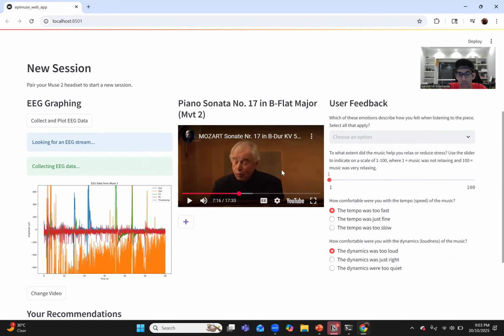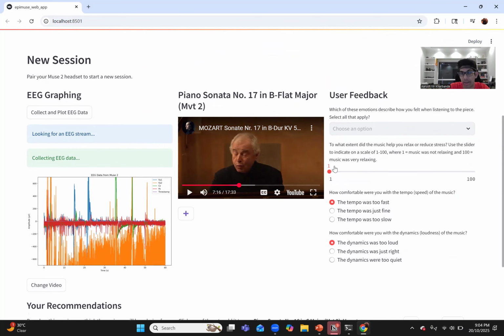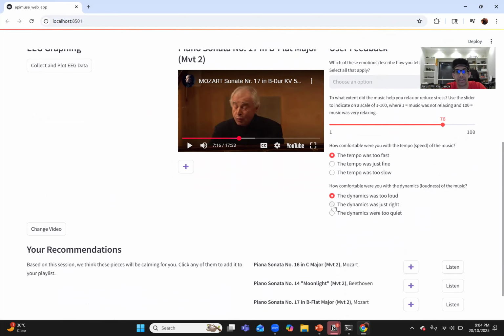Once you complete your session, right now it's just set to 60 seconds for this demo. But in a proper case, you would record it for the full duration of the music piece. You can complete this user feedback where you can describe how you felt when you listened to it. You can describe how relaxing it was, self-reported. And then you can talk about how comfortable you were with the tempo and the dynamics.